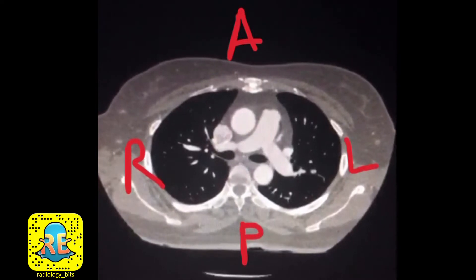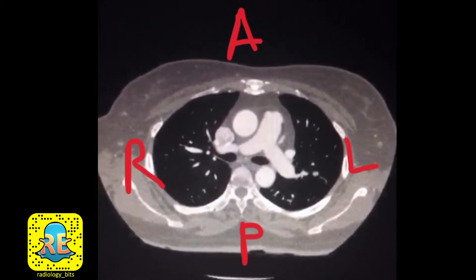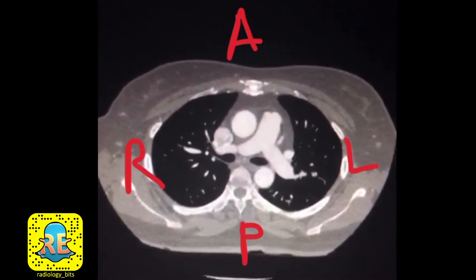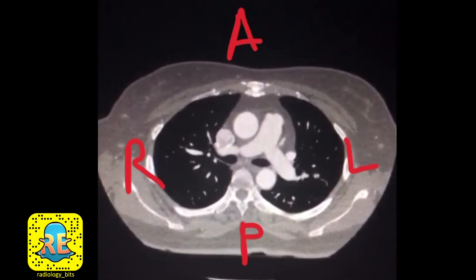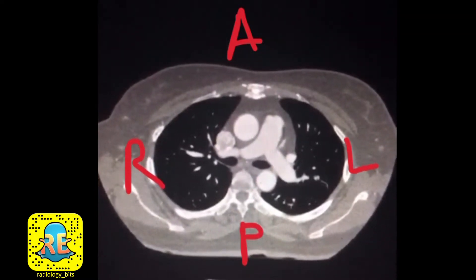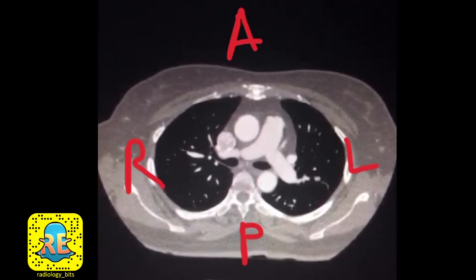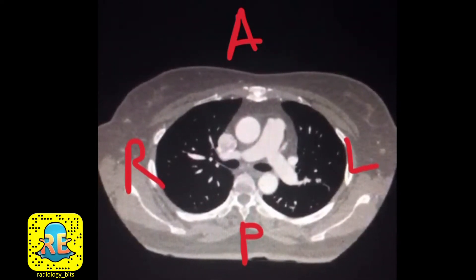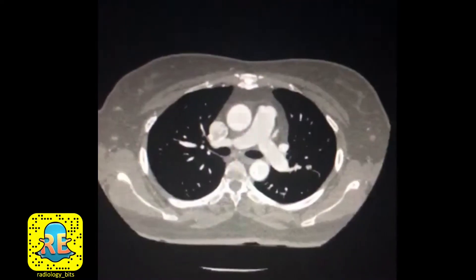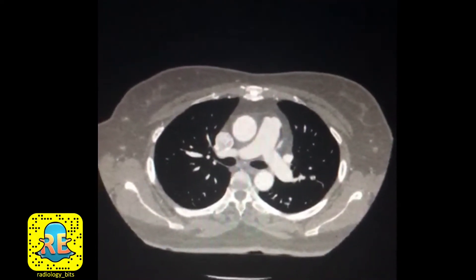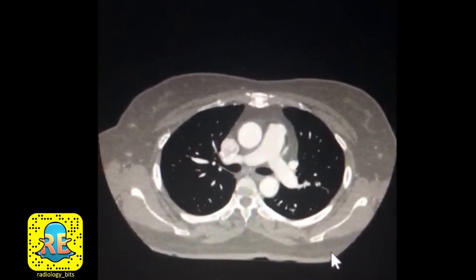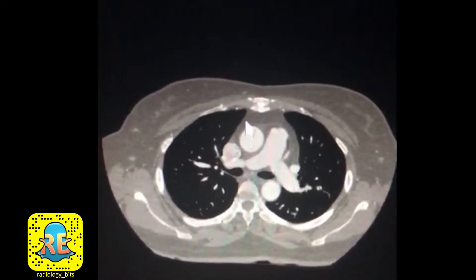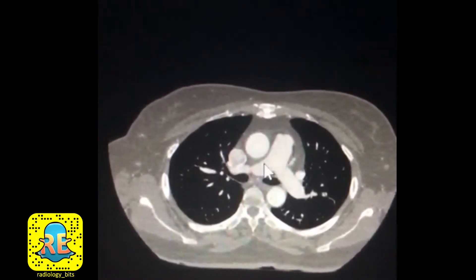As we go along I'll explain a few basics to make this more interesting to those who are not in radiology, in particular students and interns. You're looking at a CT scan of the chest, looking at the patient from his feet, and that's why the labeling is as you see: anterior, posterior, right and left. The study is with intravenous contrast, and the reason you give contrast is to see bright structures.